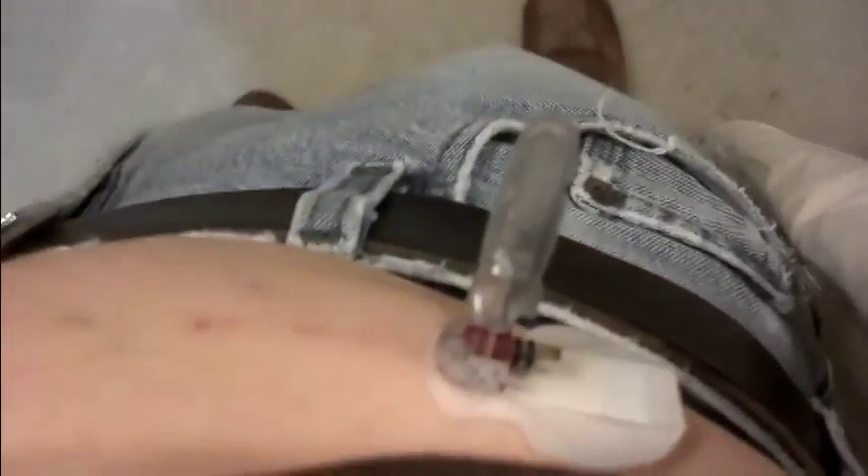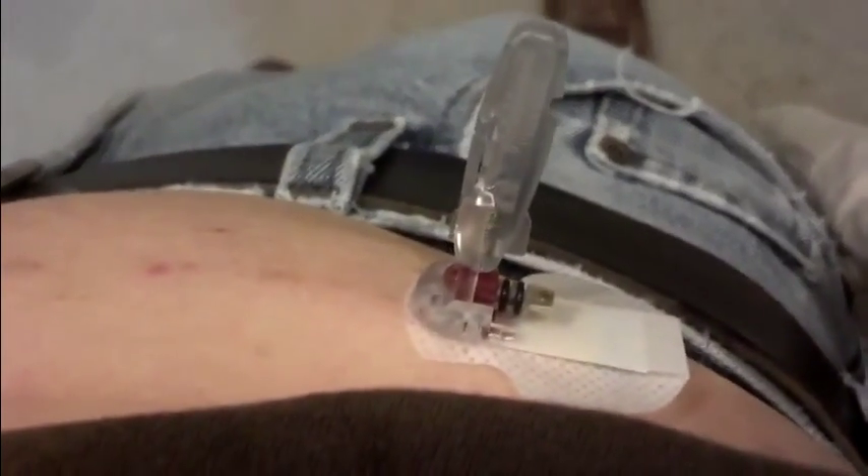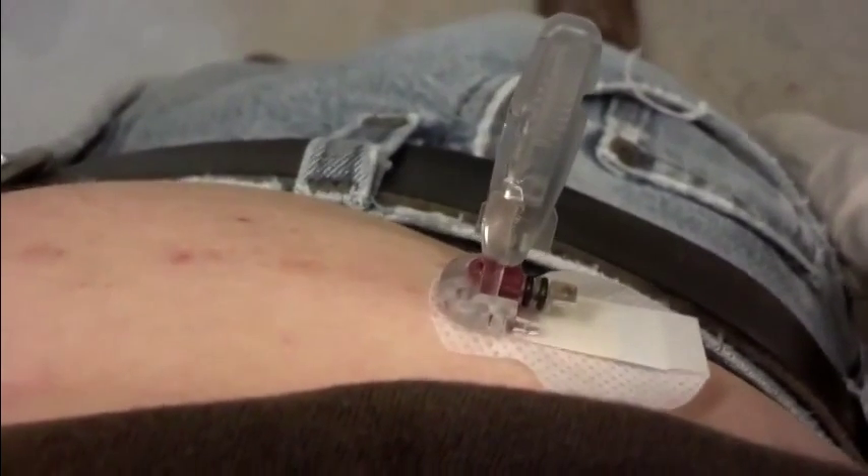This one that I'm inserting, I'm having problems with. I'm about 30 minutes into it right now and I've given up. I've been twisting, pulling, poking, and as you can probably see by the color, bleeding.